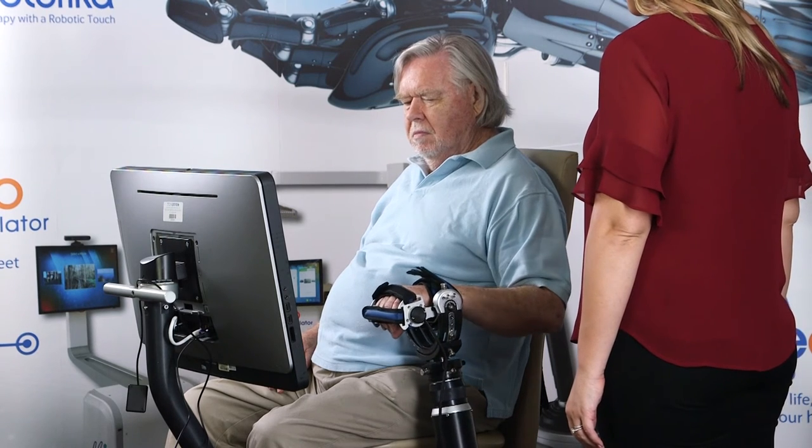The use of robotics allows therapists to bridge the gap between traditional therapy and the need for high dosage treatment to see increased outcomes. In traditional therapy sessions, a patient may complete 30 to 50 repetitions with their arm.